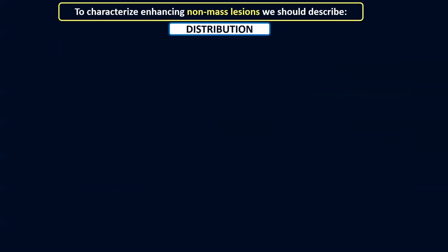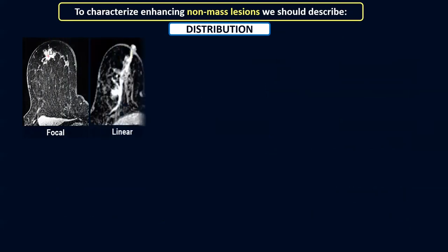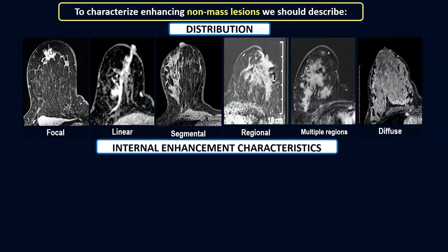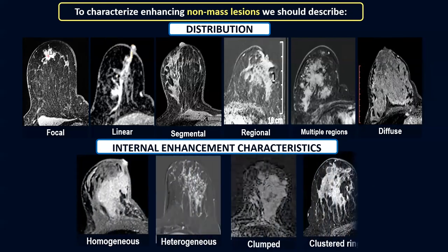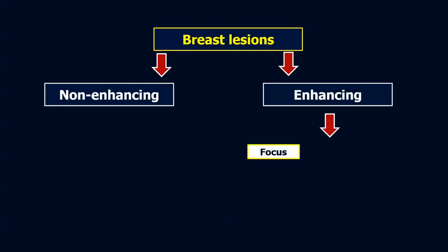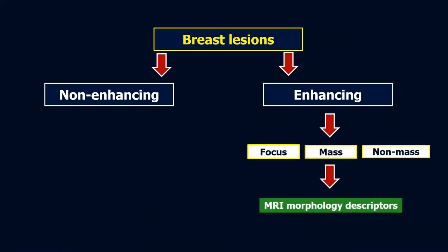We will try to apply these morphology descriptors on some lesions, following this scheme: we look at the breast lesion, determine if non-enhancing or enhancing, classify into focus, mass, or non-mass, then use the morphology descriptors to reach a diagnosis of benign or malignant.